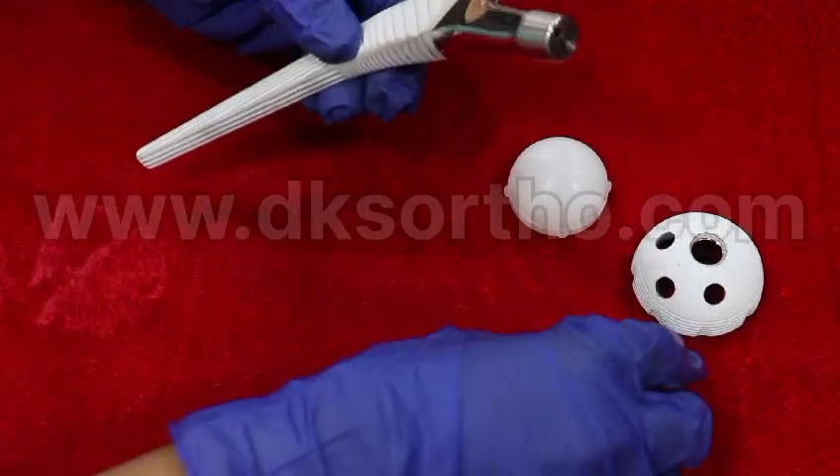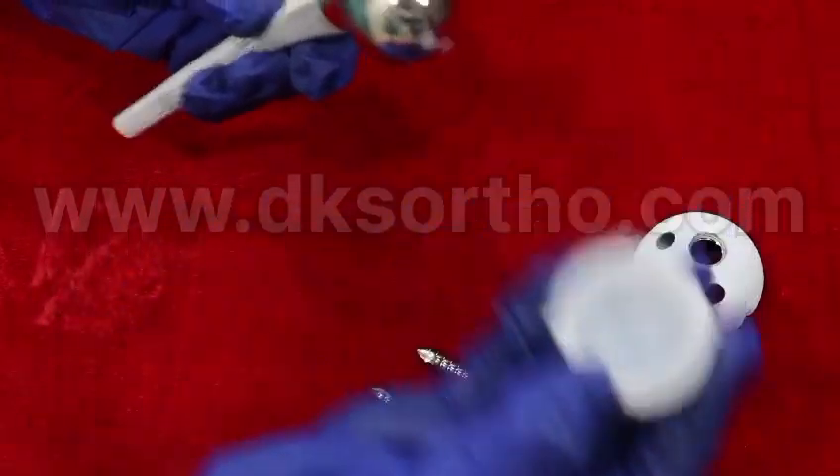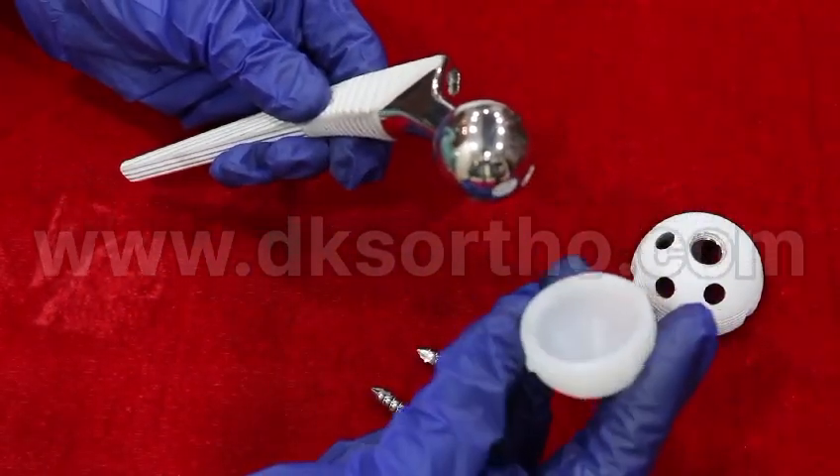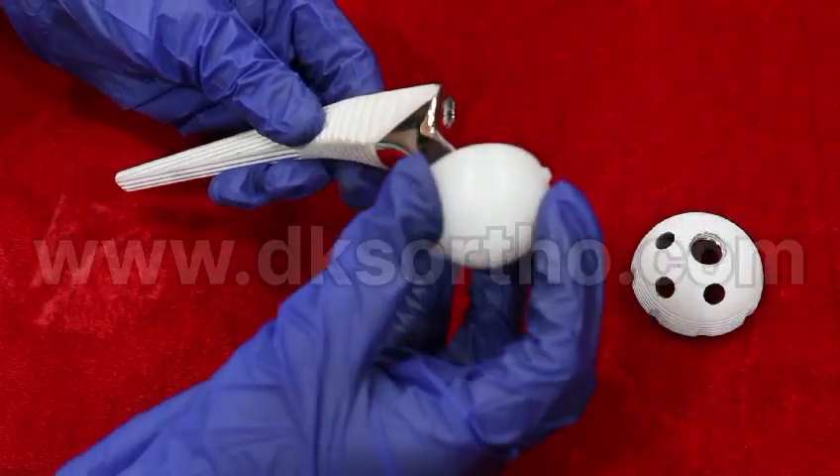We use a 28 mm internal head. The liner used is a simple liner, available in sizes from 40 mm to 64 mm.